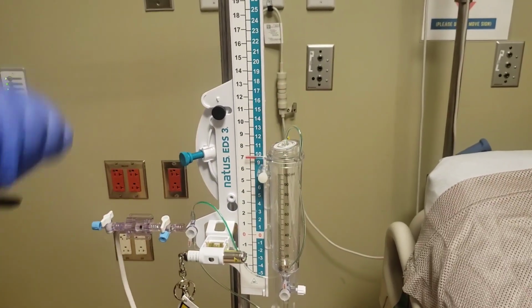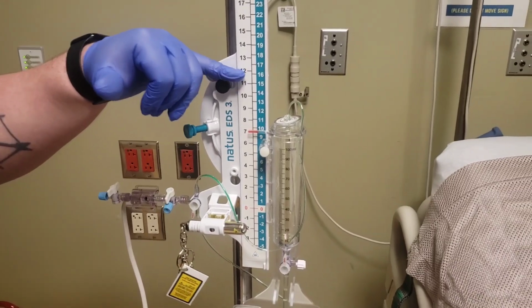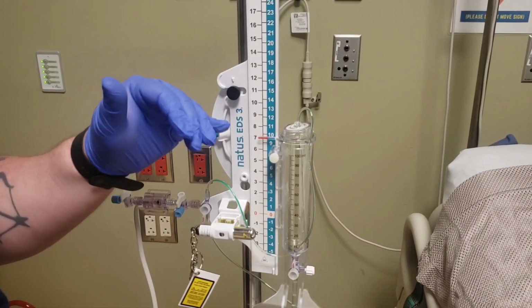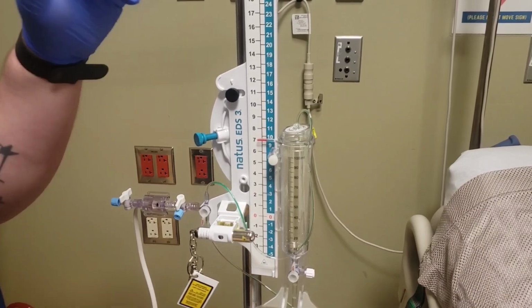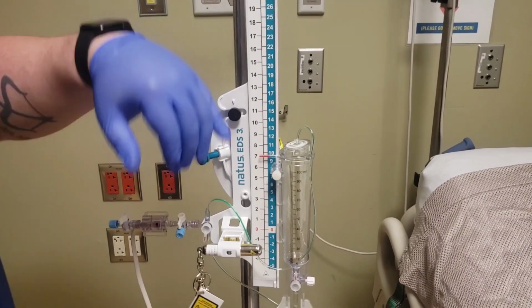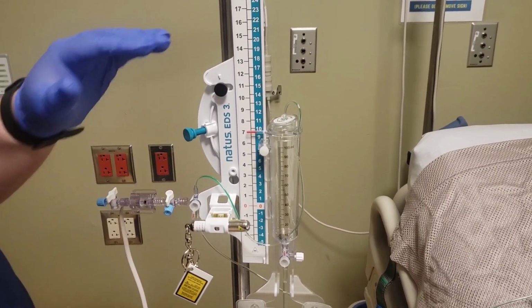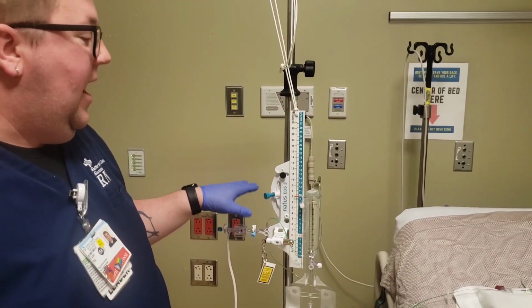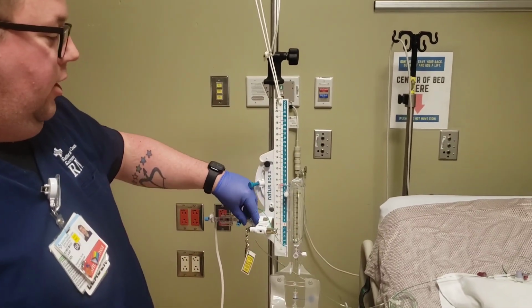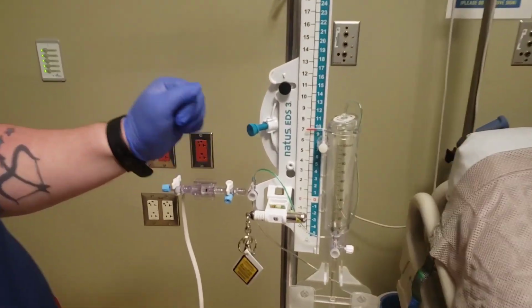7. What this signifies is that once your ICP hits 12, if you're on intermittent drainage, you're never going to get below 12. And we do want it to drain a little bit so that we don't go over. We want to try to hit that sweet spot at 12. After draining to your prescribed level by your physician, you're going to clamp your drain by turning your stopcock off to the drain.